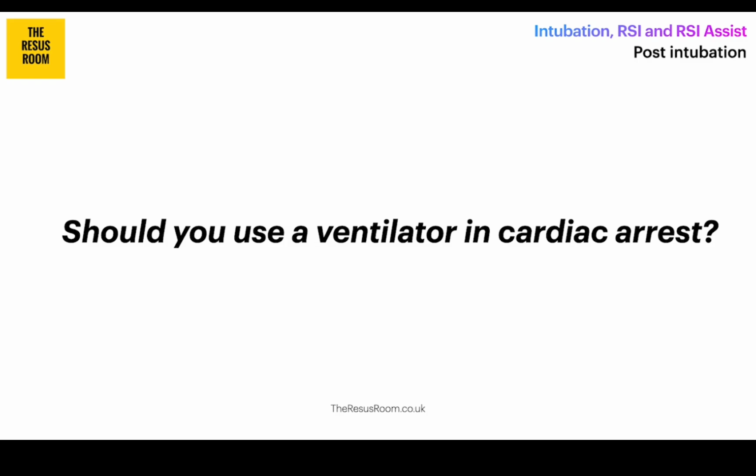And finally, you mentioned those pressure alarms, Rob. I would turn those right up to maximum so that you're not getting the alarm, but you're also not getting a blow off, so that you are delivering the volumes that you think you are.